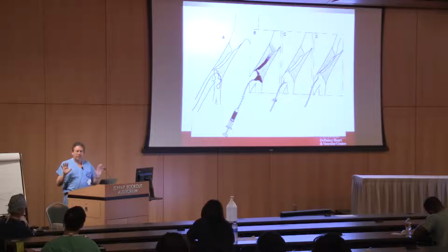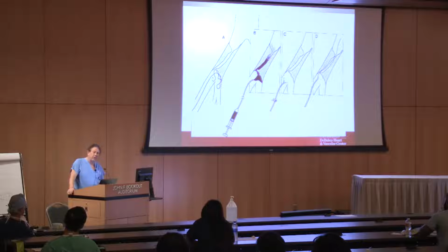And so that's a way the background landmarks can be of some value in trying to understand what's going on. But by and large, a digital subtraction angiogram is only going to show you the black part here. It won't show you anything else. And the way we have it set up in the hybrid room is we will take that digital subtraction study and overlay it on top of the live fluoro image.